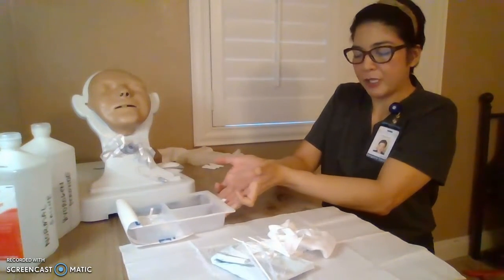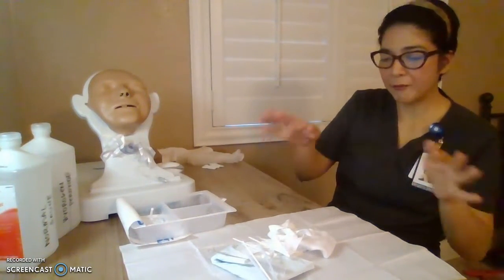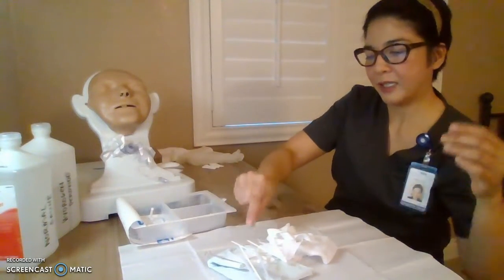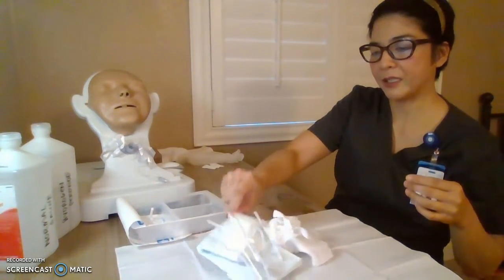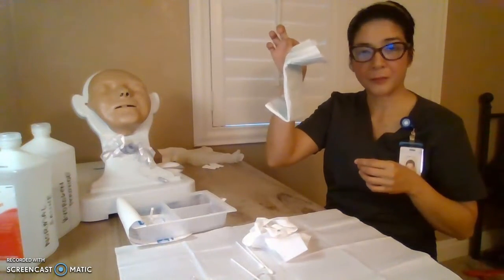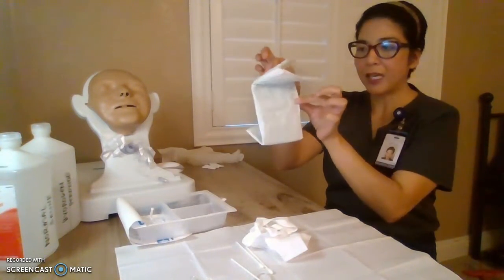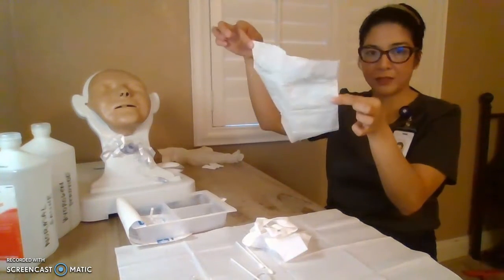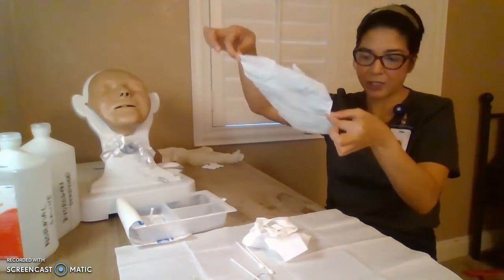So I'm just going to move that over for the purpose of the video. I just need to move everything. And I need to get the sterile gloves. All right. So you have leeway as well to touch the edge of the glove, I mean the packaging.